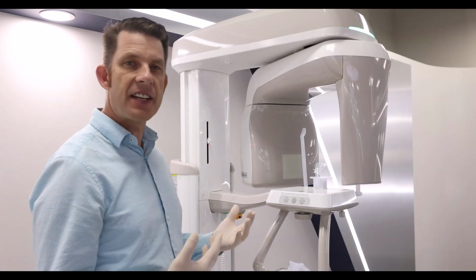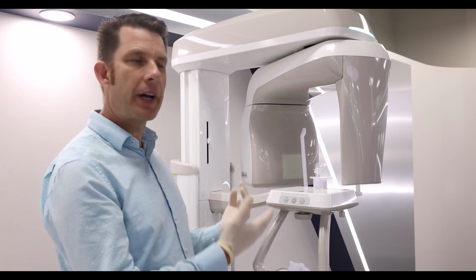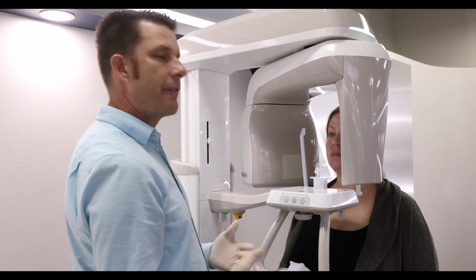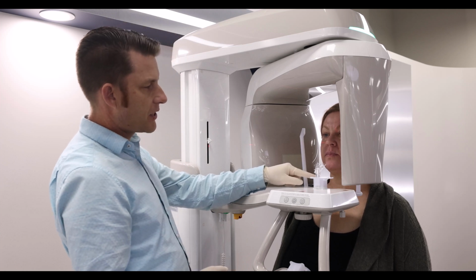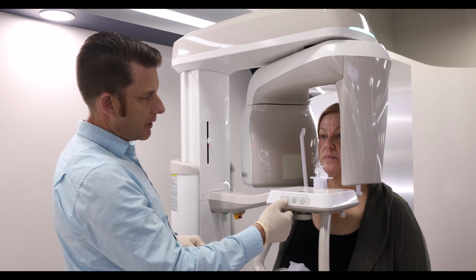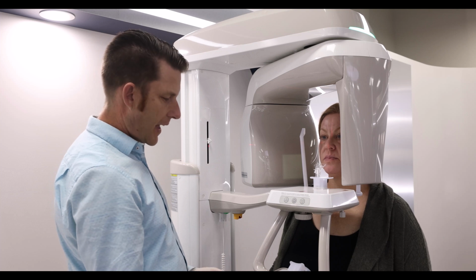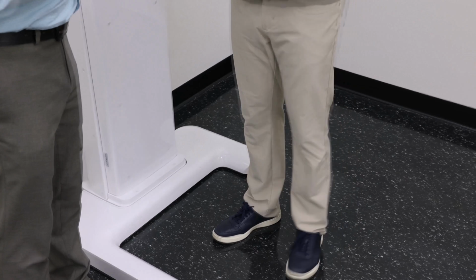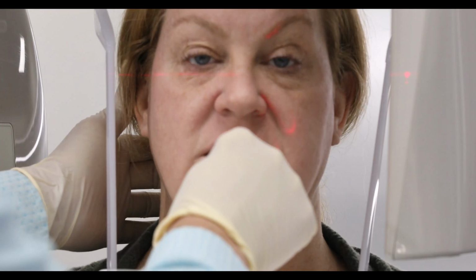Once our device has initialized, we can see that the positioning beams have been illuminated. I'm going to go ahead and bring our patient in for patient positioning. Having our patient stand up straight and tall at attention, I want to evaluate the patient's chin to the base of the chin rest. I want to use my touchpad and bring the device just below the patient's chin. Next, I'm going to start with the hands, palms facing up, feet step forward a little bit and shoulder length apart. I'm going to have the patient open and go ahead and bite on our bite stick.